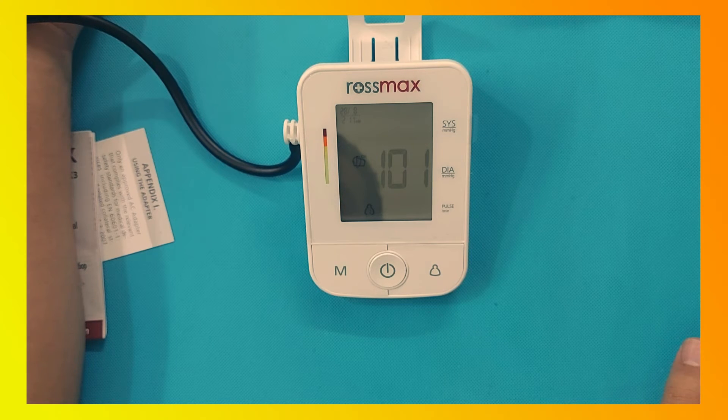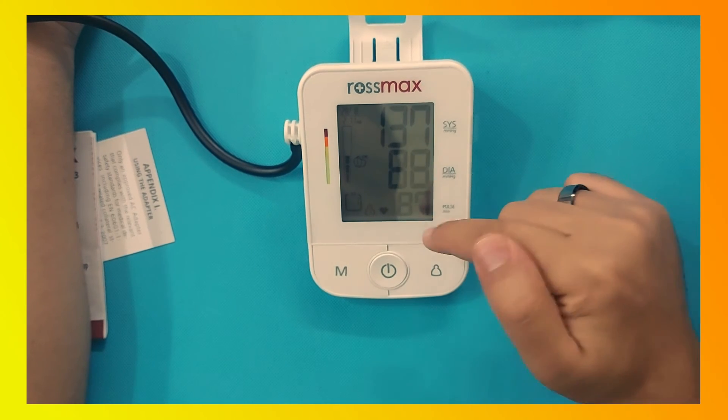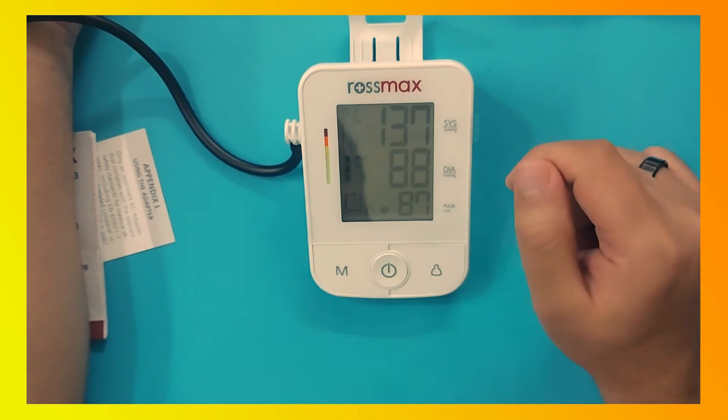If there is an irregular heartbeat, the device will show a special sign for irregular heartbeat below the diastolic and above the heart rate reading. The current blood pressure reading is: 137 systolic, 88 diastolic, and 87 heart rate.